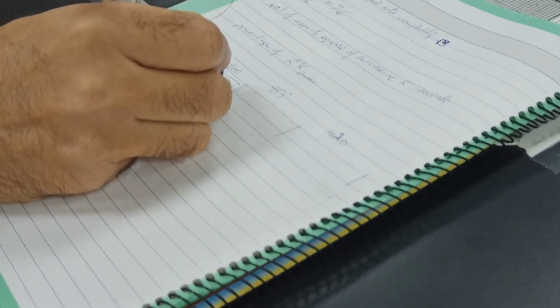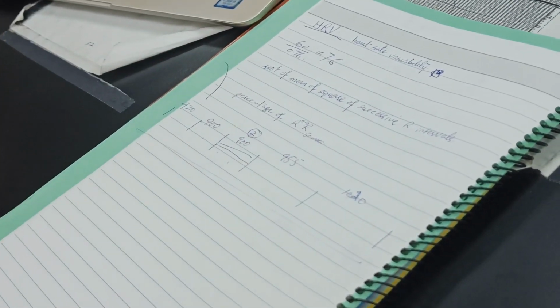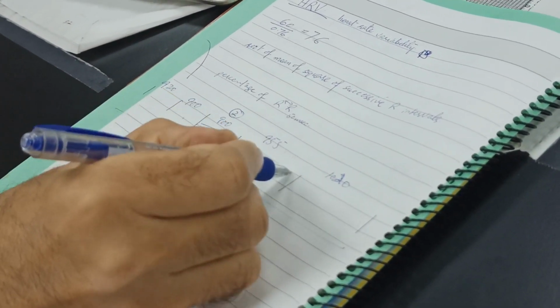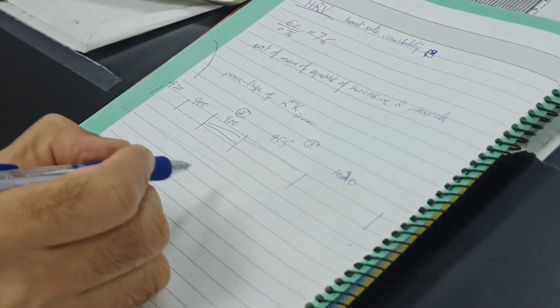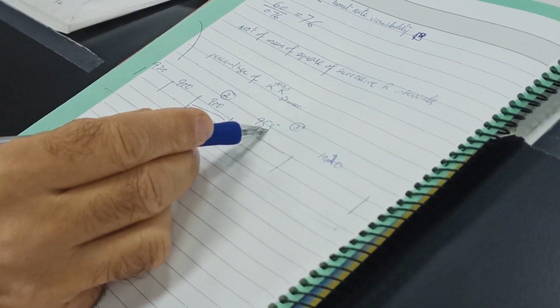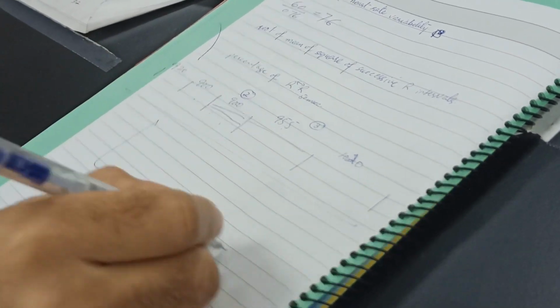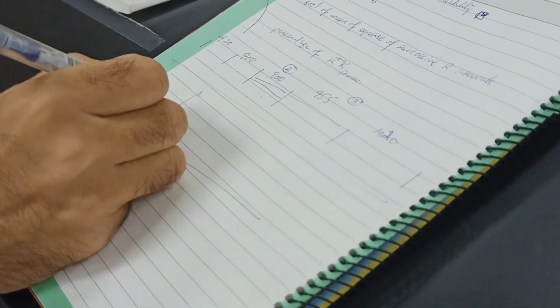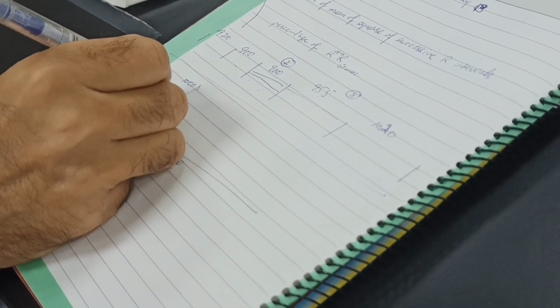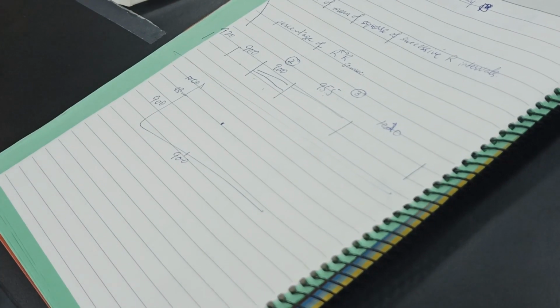Say this is RR interval number 2. The next RR interval is RR interval number 3. It is 955 milliseconds. So the plot is between these 2 points. If I plot here 900, 900, 1000, so this is 950. So my plot, this point is this one.